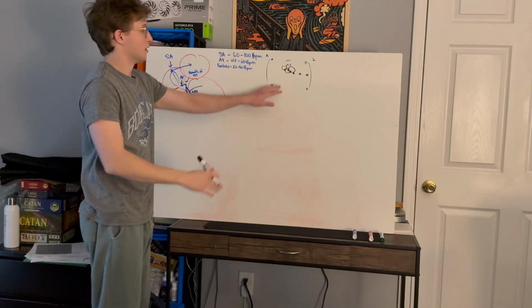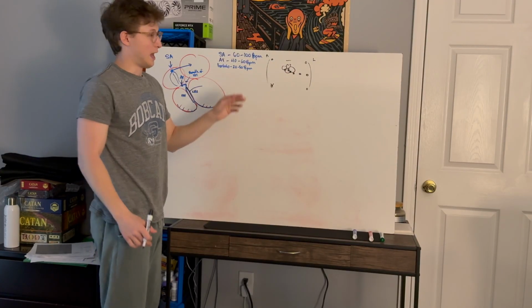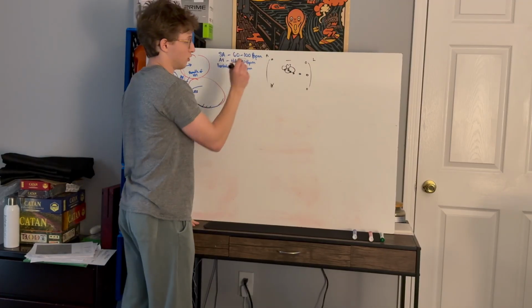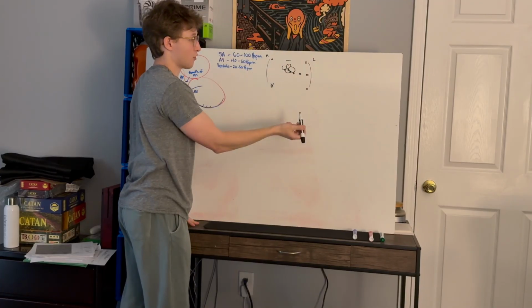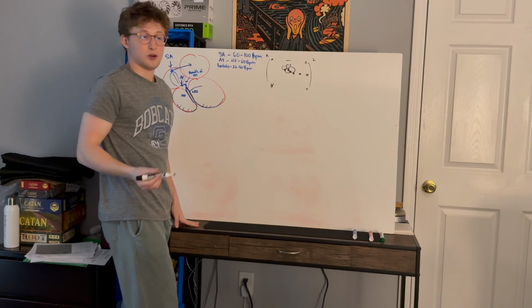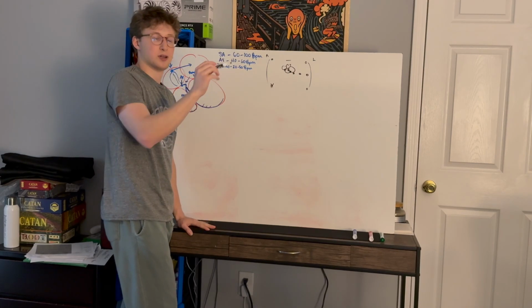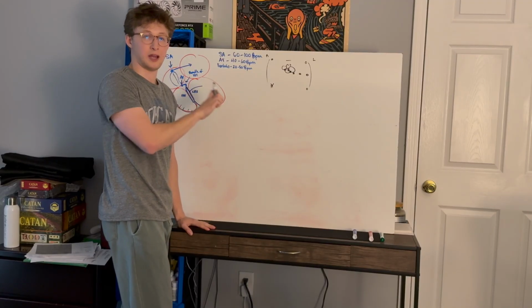They're not perfect, but the point is that these are our electrodes and they create different leads. They each look at the heart at different viewing points. And so on our ECG, you're seeing a different picture in each lead because you are viewing the movement of electrical activity, the movement or change in voltage in the heart from different angles.